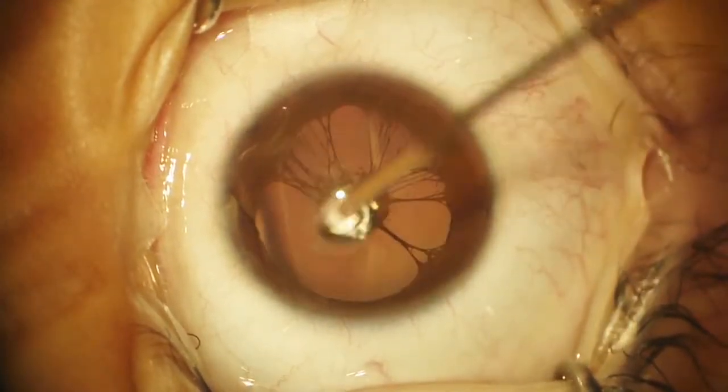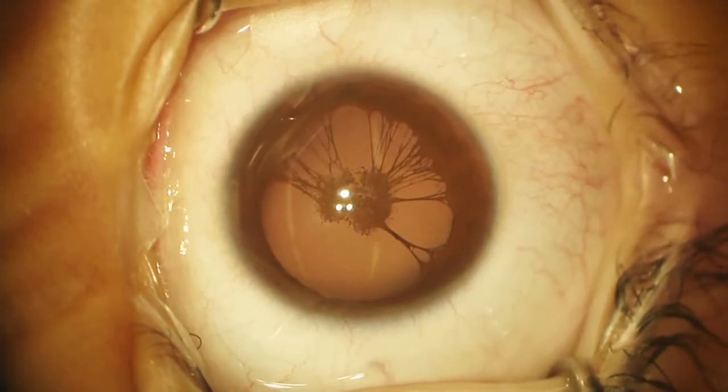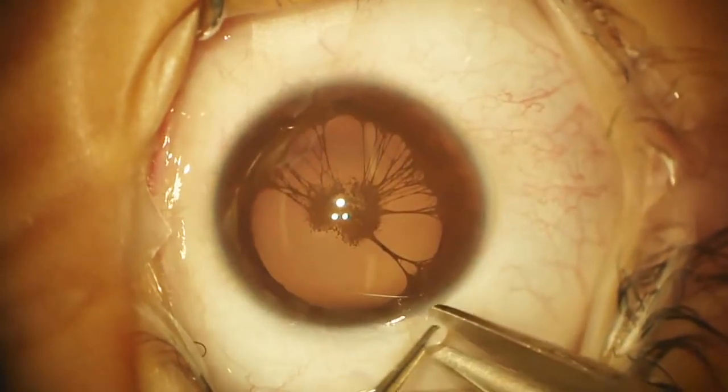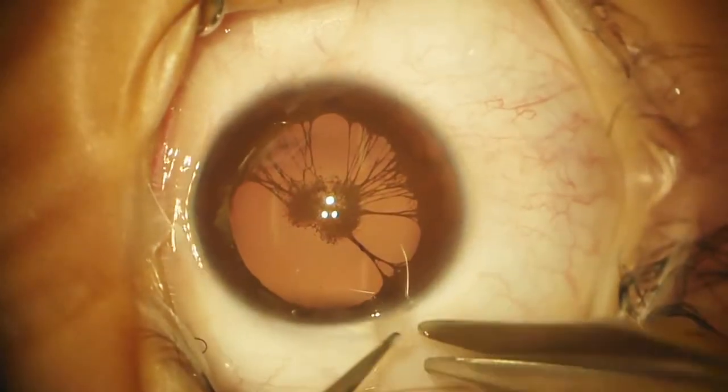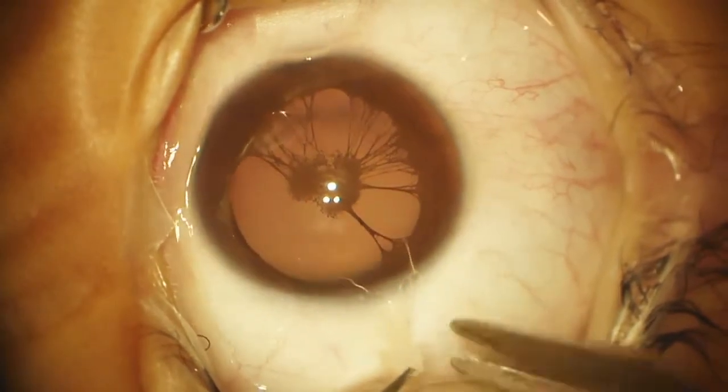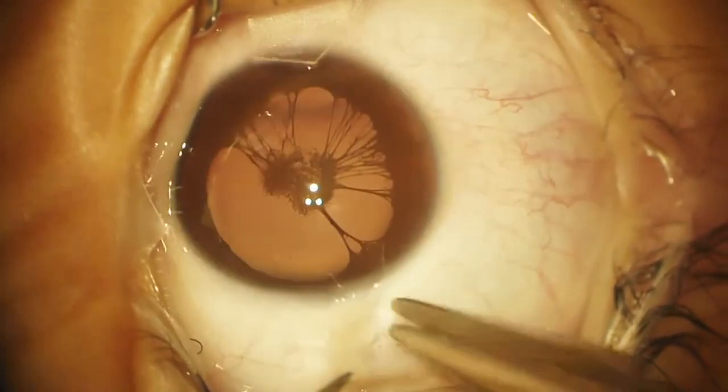This is a six-year-old little girl who has a pupillary membrane with persistence — an embryologic failure to regress. As a result, she has a central opacity with iris strands and decreased vision.